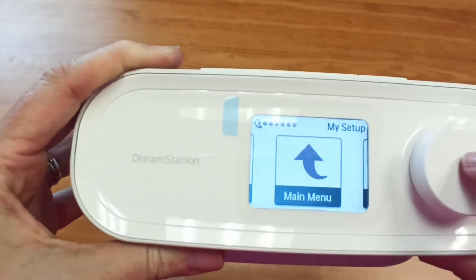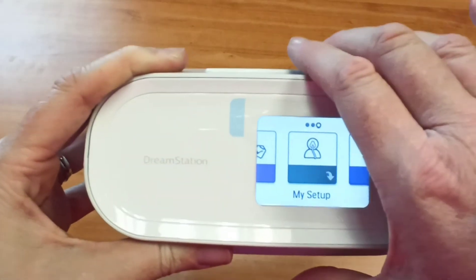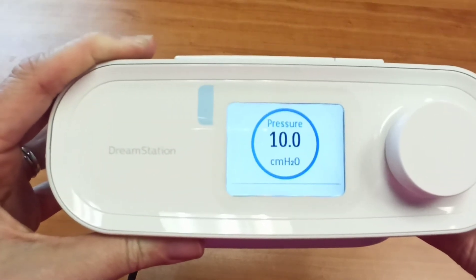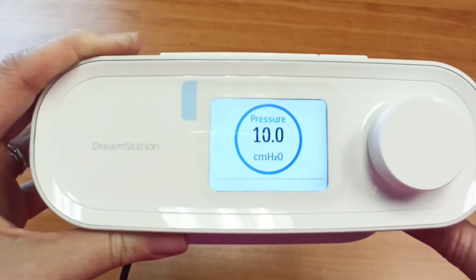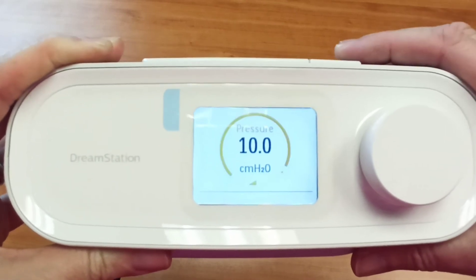You can go back to your main menu and click out. This time when you start your machine, your same pressure will be there as always. But if you choose to ramp it down, when you hit the button, it will drop to where you've told it. In this case, I've asked it to drop to five.